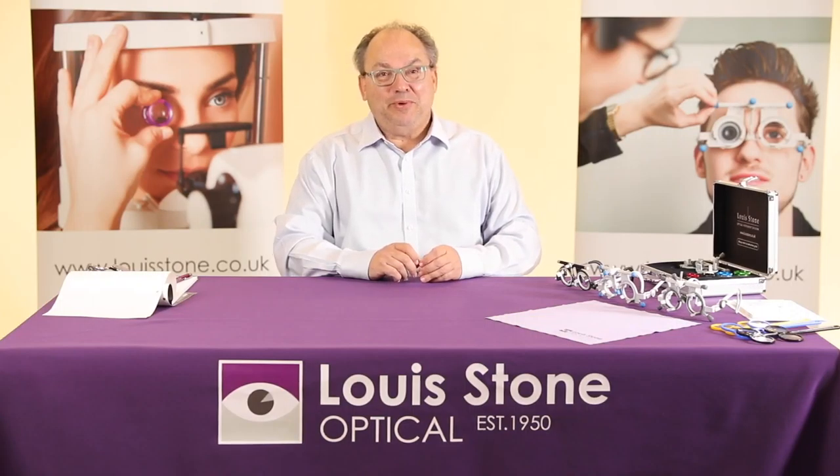Hi there from Lewistone Optical of the UK. This is our first series and today we're looking at instruments — mainly we're going to have a good look at the Oculus trial frames.